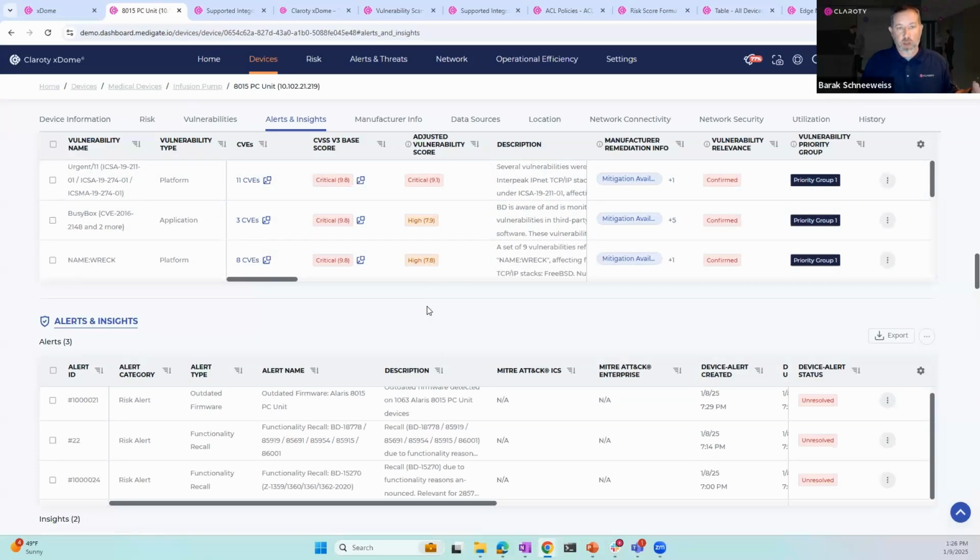And we do this across the breadth of all devices on the network that we're seeing. Medical, OT, IoT. Is it exploitable? Do we see it out in the wild that there's an exploit that's available? Are we seeing internet connectivity to this device? Is it with other devices that it shouldn't be, like in a mixed VLAN, something where it makes it unsafe? So we're doing all those things together, and then we're building that exposure management around that device. How can I best protect this device?